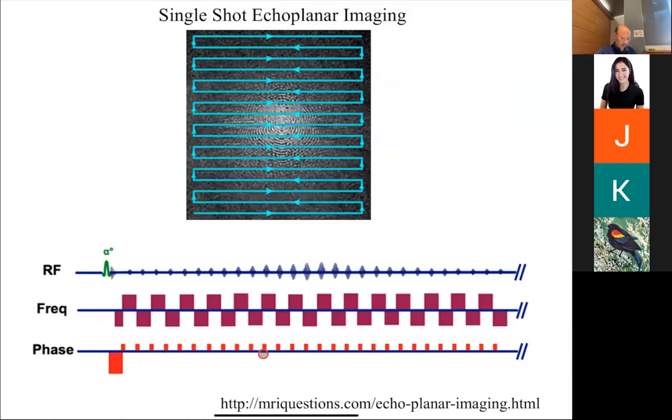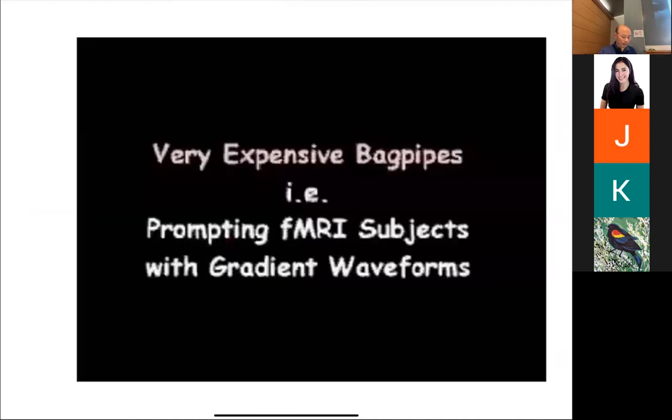So this is certainly, if you're looking for projects, echoplanar imaging is definitely a rich area to look in. There's actually even a project from many years ago that you can use as a template if you want to do that, okay? So that's all we'll talk about later. Okay, so the gradients, it turns out, the moving of the gradients typically happens on the order of, we're switching them on the order of half a millisecond to a millisecond.